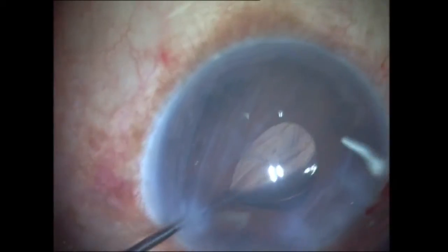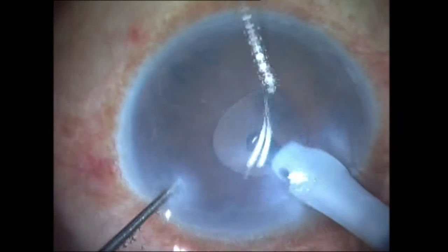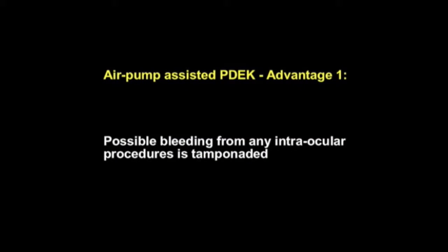So I think it'll probably be easier if I can show it on the video. Oh, absolutely. Let's go to that beautiful video now. All right, Josh, so you can see that this was a patient who had ICE syndrome. He's got peripheral anterior synechiae all over in the periphery. I've already removed the cataract and put in an intraocular lens.